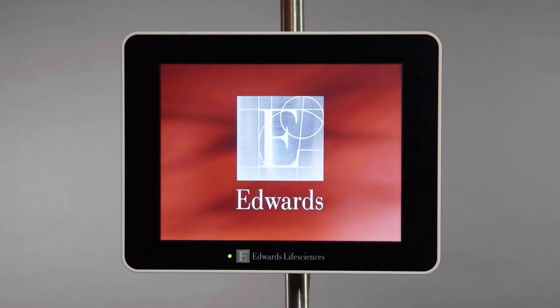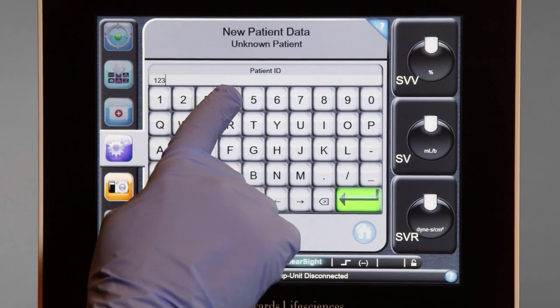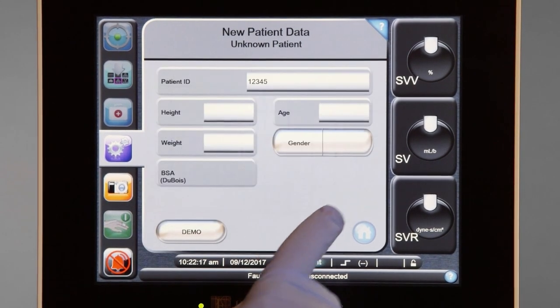After the startup screen, enter the patient's ID number as well as their biometric data: height, weight, age, and gender.